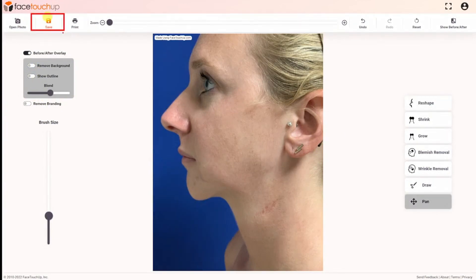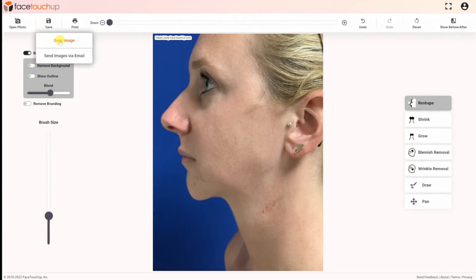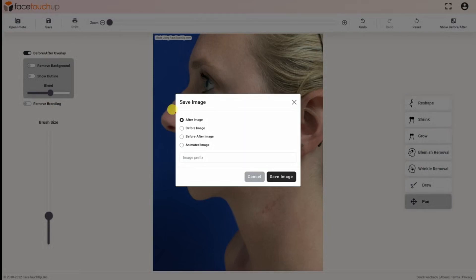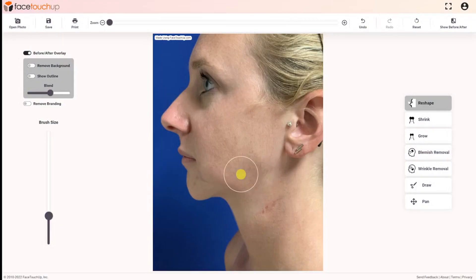To save the simulated images, use the save menu from the toolbar. From the dialog, choose the options to save before or after, or animated images as needed.